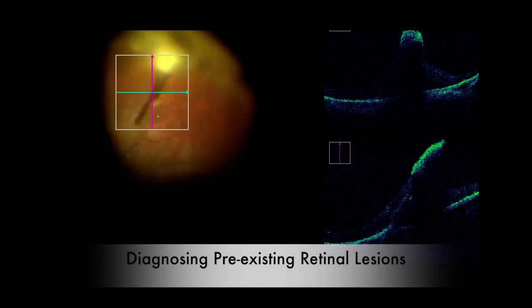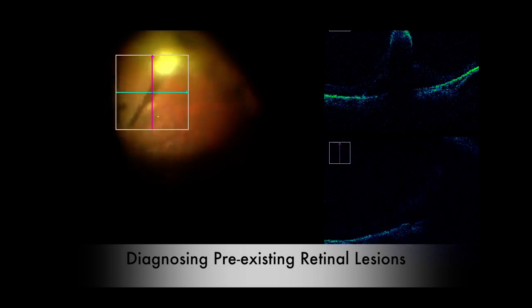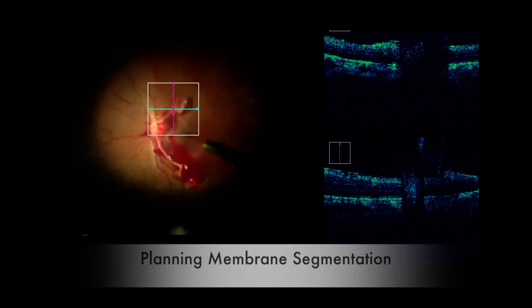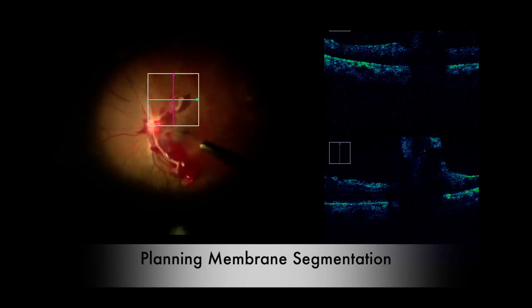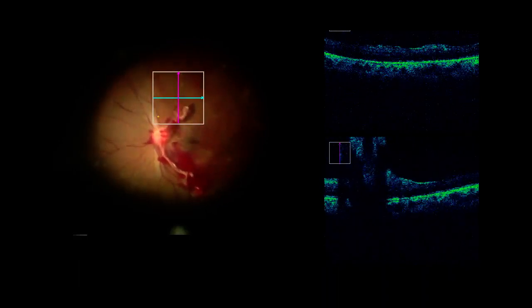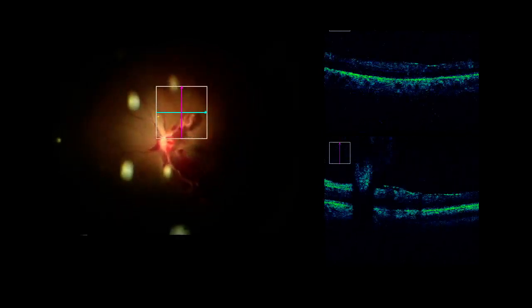Our use of intraoperative OCT has helped us in differentiating pre-existing from iatrogenic retinal lesions, including those in the far periphery. Intraoperative OCT is also invaluable in planning membrane segmentation. Intraoperative OCT allows us to differentiate neovascular membranes from the underlying retina and hence prevents the formation of iatrogenic retinal breaks.